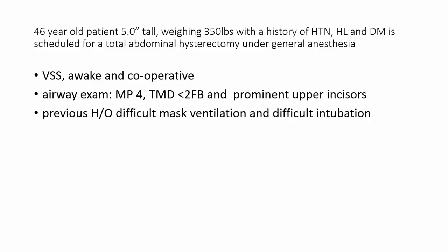Based on the information available, the airway examination, and the previous history of difficult mask ventilation and difficult intubation, it is reasonable to secure the airway by awake fiber optic intubation. When faced with a difficult airway, awake intubation is the gold standard for airway management. Preparation begins with a careful history, a physical examination, and a detailed discussion of the procedure with the patient.